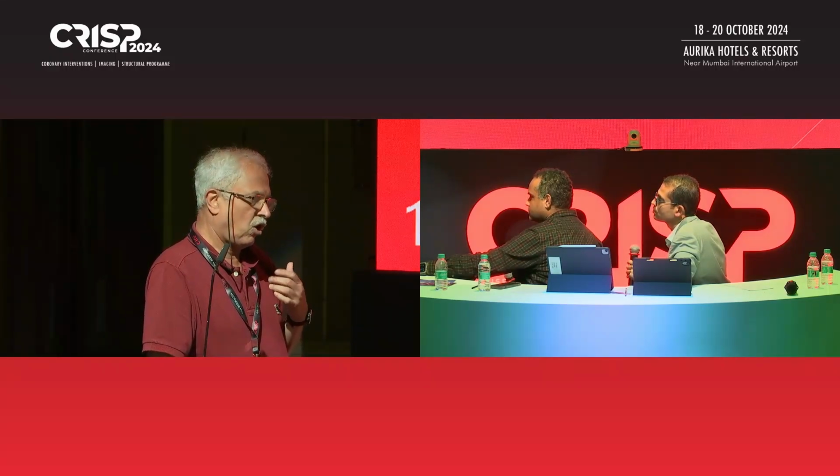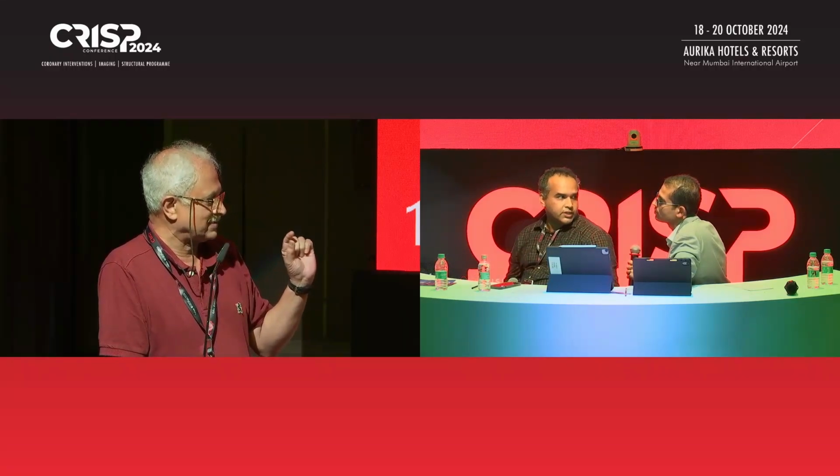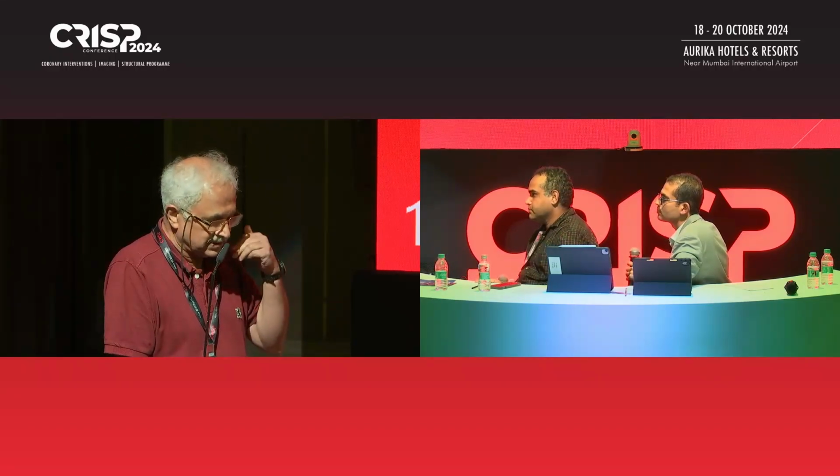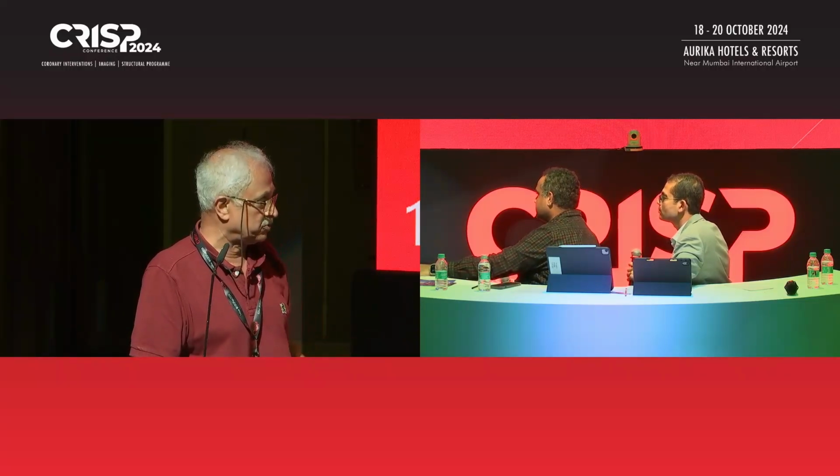One is that although we are able to see the length of the rim, we cannot judge the strength of the rim in every patient. It is our subjective feeling that probably this rim may be able to take it.